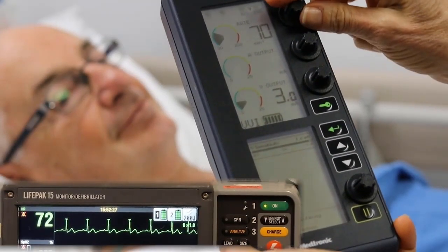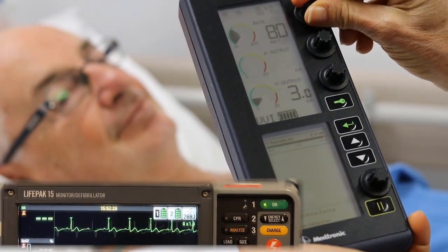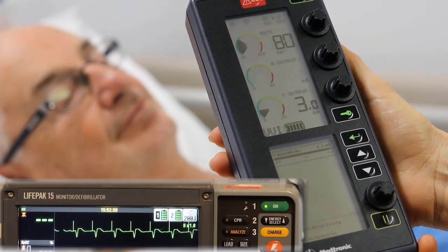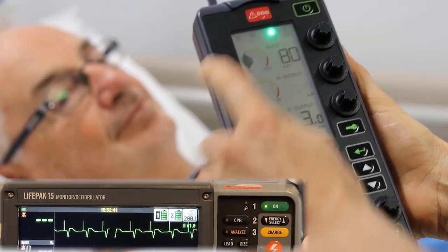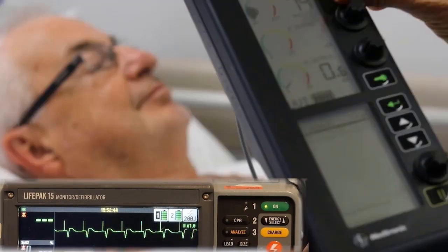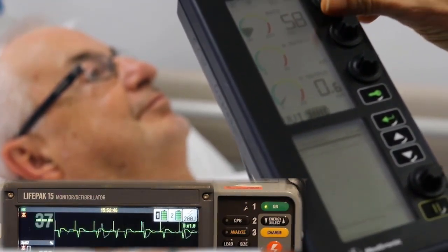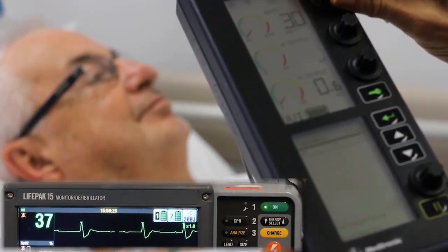If the patient is not being paced, then increase the pacemaker rate to 10 above the patient's rate. If the patient is already in a paced rhythm, turn the pacemaker rate down and observe the ECG monitor for the patient's intrinsic heart rhythm.